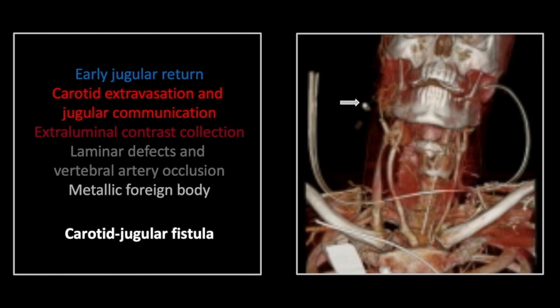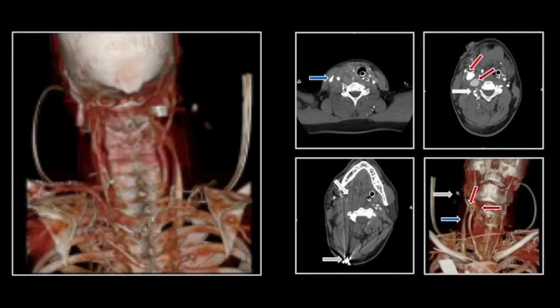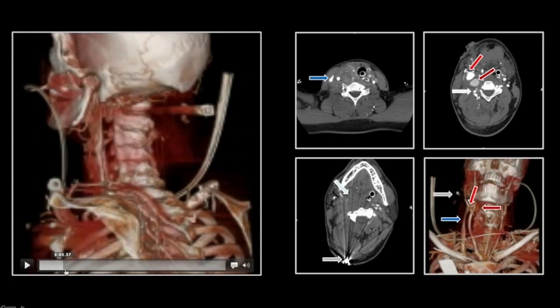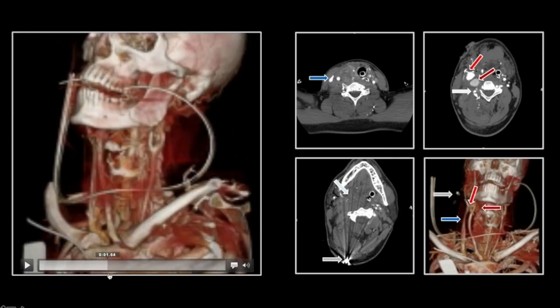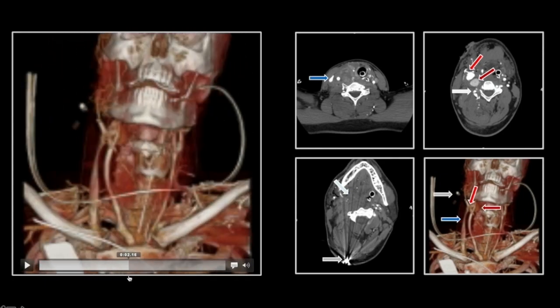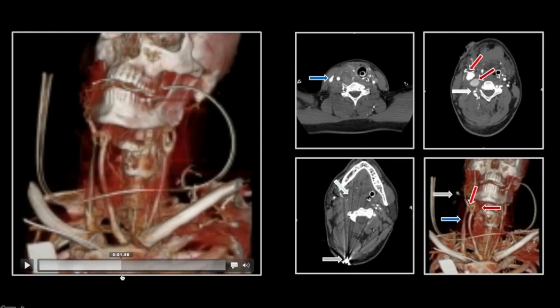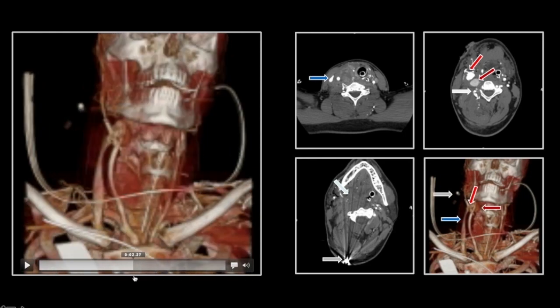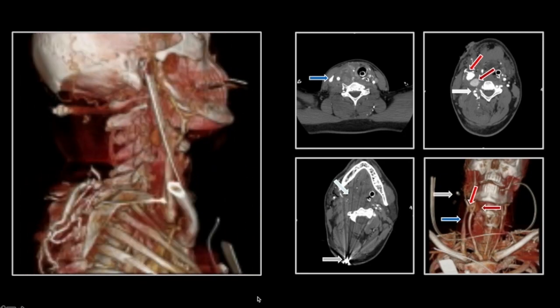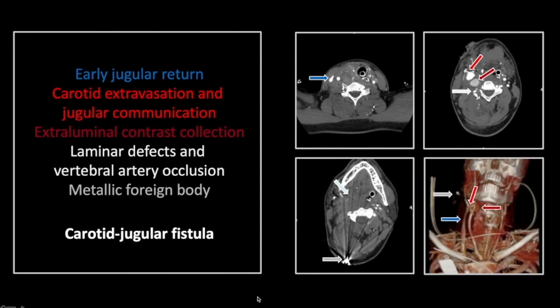Lastly, there is the bullet. Here you see nicely the pseudoaneurysms arising from the carotid and that communication between it and the jugular resulting in the early jugular venous return. So that is a case of carotid jugular fistula formation with carotid pseudoaneurysm and vertebral artery laceration and occlusion.